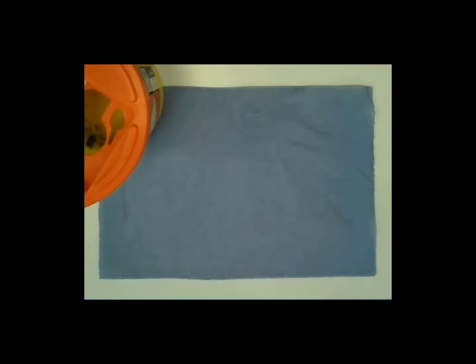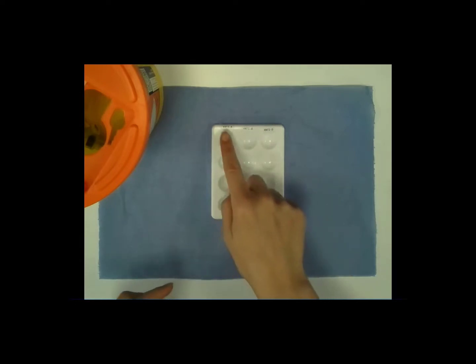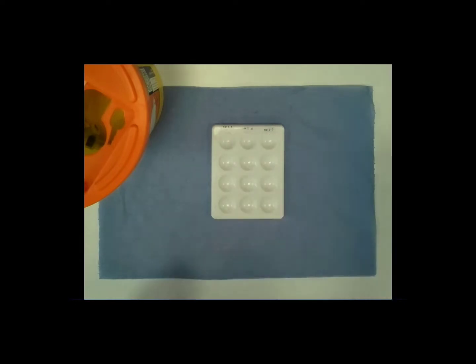In this video, I'm going to show you how to set up a plate for blood typing. First of all, you're going to need to get all of your equipment. You need a plastic tray with wells to put the antibodies and blood in.